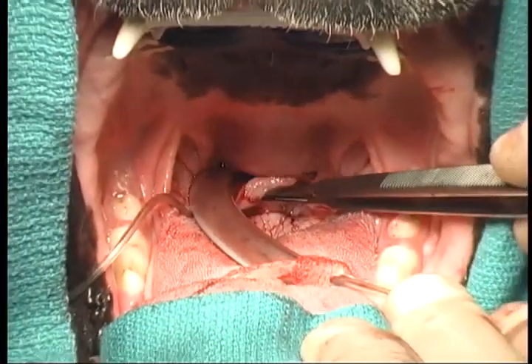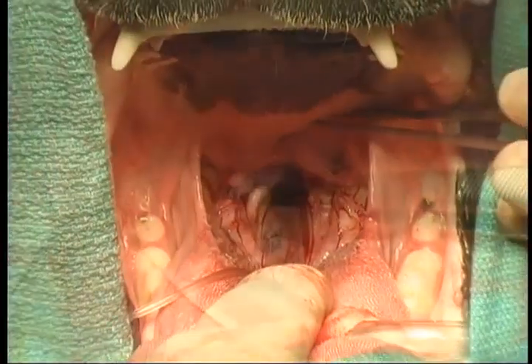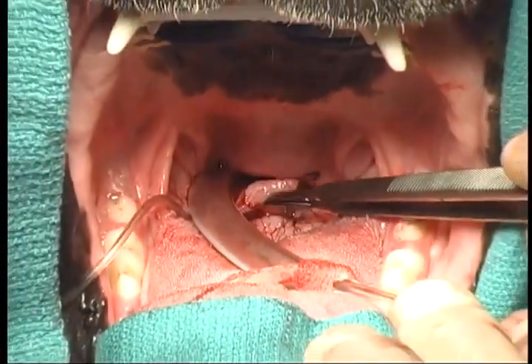Notice that once the knots are cut, it actually does show that the suture is very supple against the mucous membrane and therefore very comfortable.